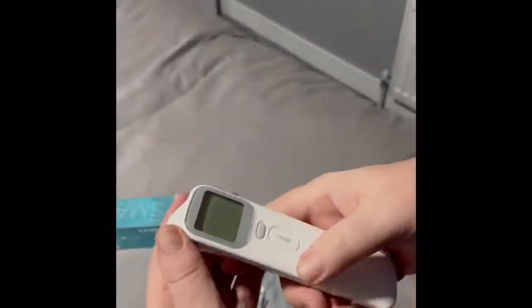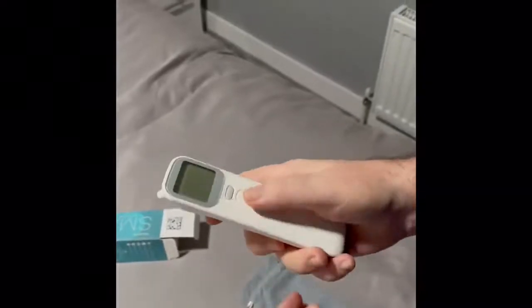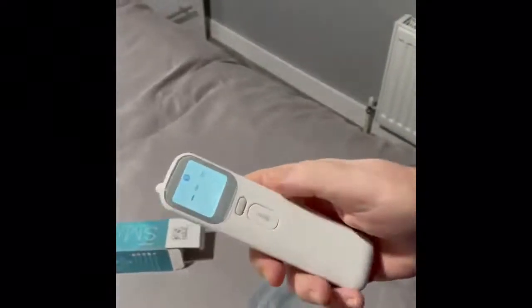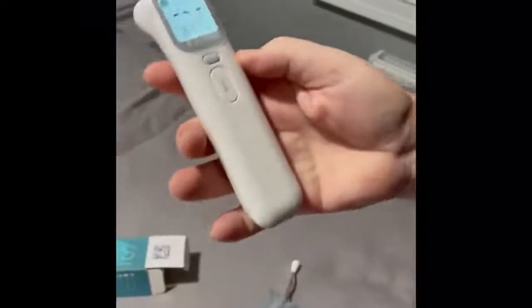Now I'm going to do an ear temperature. So I've removed the magnetized cover. I'm going to power the unit on, which automatically comes to the ear. I've got to maneuver the ear to get the sensor in, which is all explained in the pamphlet. And that's the temperature of the ear. So that's that. And I'll put the cover back on.